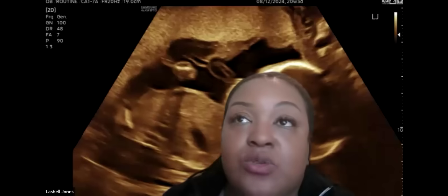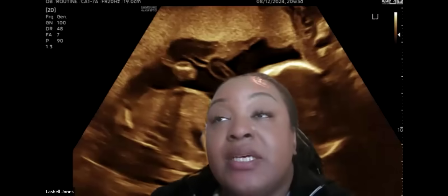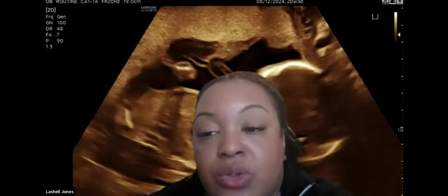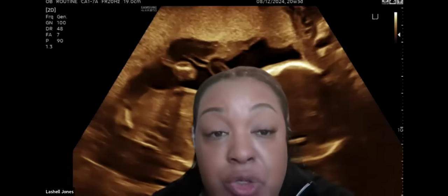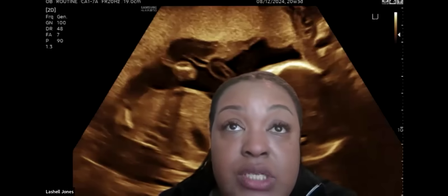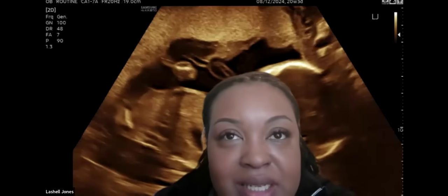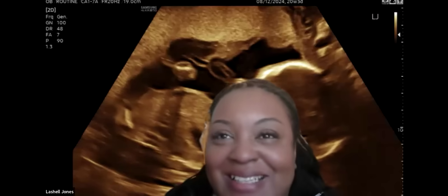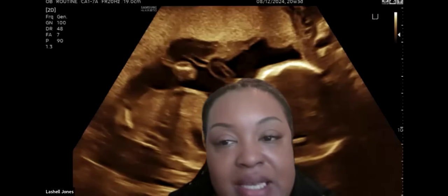Absolutely. Even in those cases where it doesn't match, I've seen the doctor recommend additional ultrasounds. They always say that potentially things could come up even in the third trimester, which I've seen. I've seen where there was a normal screening but absent nasal bone and a thickened nuchal. I'm like, what? I don't get that. But we followed that case.